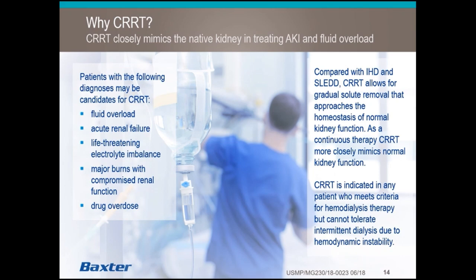But if you compare IHD and SLED with CRRT, CRRT allows for gradual solute removal that approaches the homeostasis of normal kidney function. In other words, CRRT closely mimics our own native kidney in treating acute kidney injury and fluid overload.